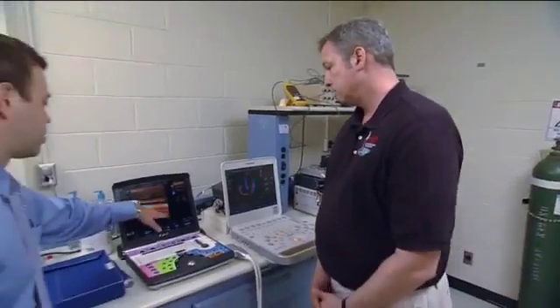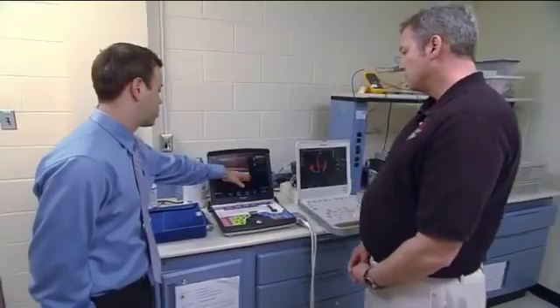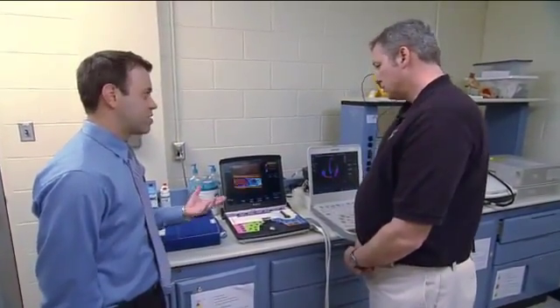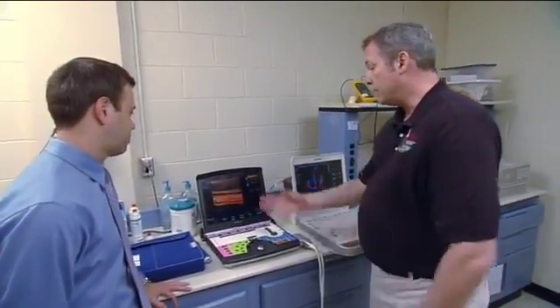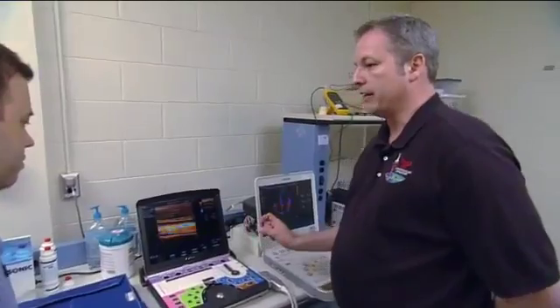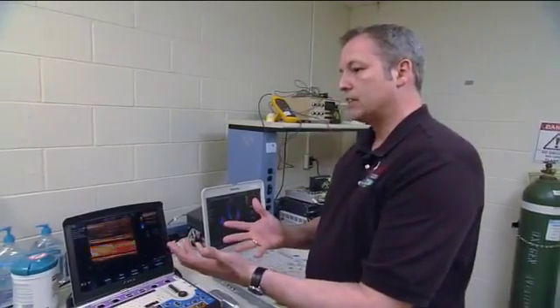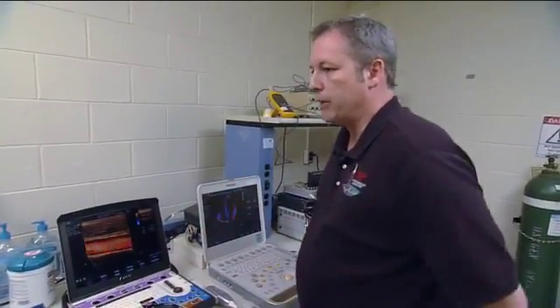So you're talking about the different colors and the Doppler effect. I mean, that's just like what you see on the weather every night. So the blue means the blood flow is moving in that direction. Do you take a look at how fast it's going? Does that tell you something? We do. We can look at velocity. And then if you multiply velocity by the cross-sectional area, you can actually get the blood flow. And blood flow tends to be what we use more, how much blood is going through that vessel in a minute or whatever time period you choose to use.